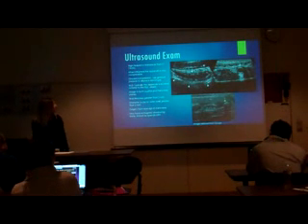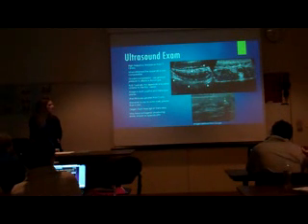We use a high-frequency transducer, of course, and we know from studying that when the appendix is inflamed, it's non-compressible. We use graded compressions. This gradual pressure helps displace the bowel gas so that the appendix can be imaged. Typically, the appendix is located anterior to the iliac vessels. It doesn't always live in that area, but that's a good place to start looking for it.